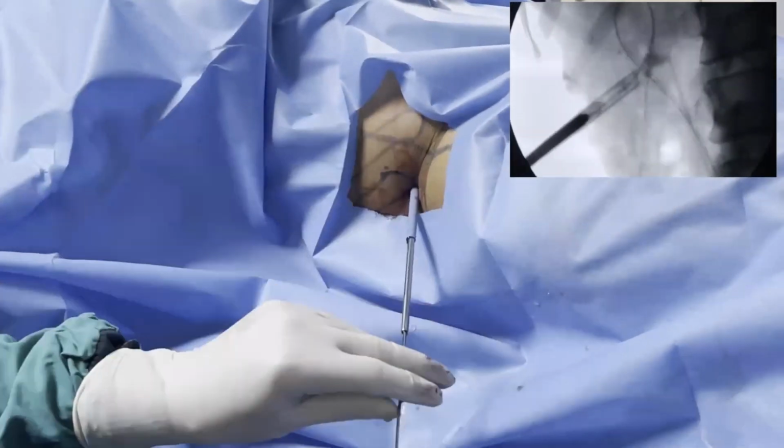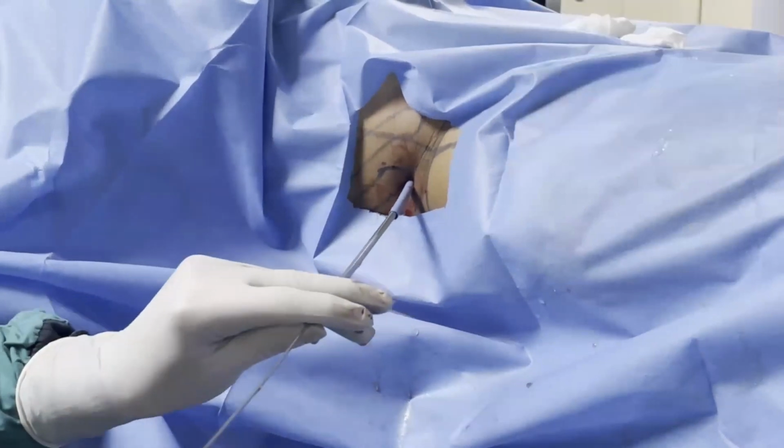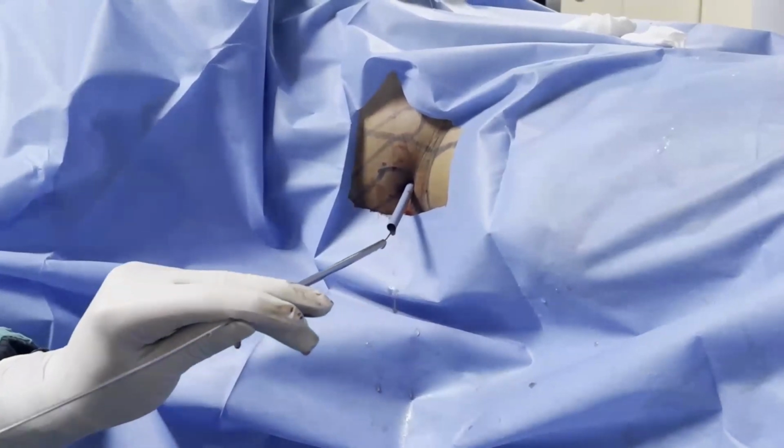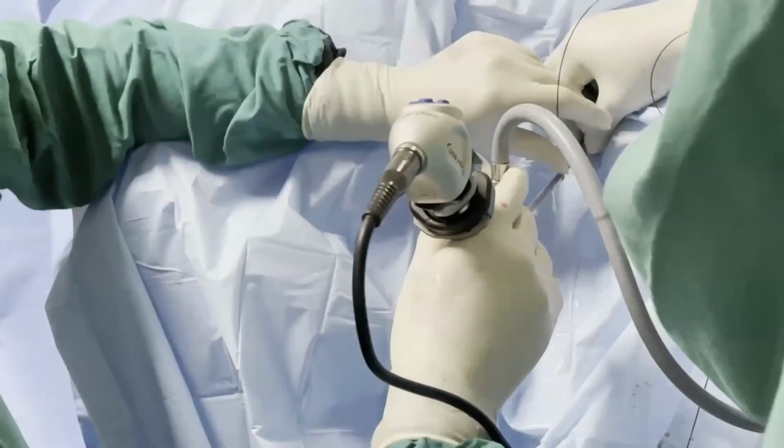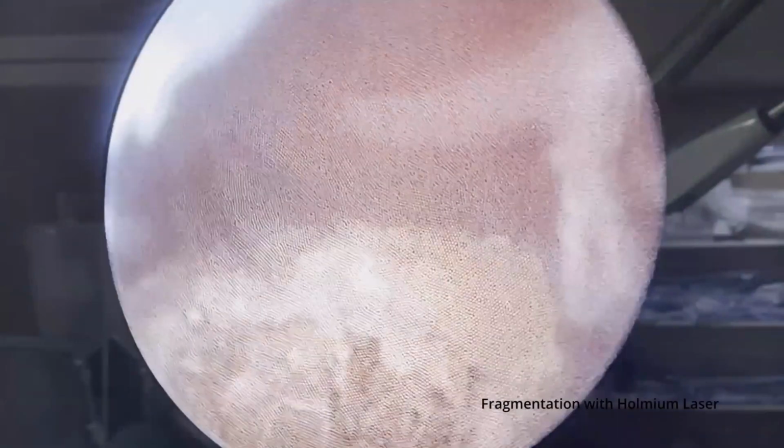We advise the assistant to continuously push the irrigation from the ureteric catheter, so that if there are any clots or small fragments, they can also be expelled out with the help of the irrigation. After placing the Amplatz sheath, we insert the mini nephroscope, and then the stone is located and fragmented with the help of holmium laser. We try to fragment the stone as small as possible, so that because of gravity, the stone itself is expelled out of the system.